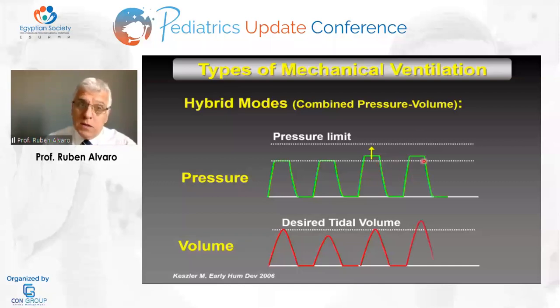But now with this PIP, the tidal volume is going to be higher than the desired tidal volume. So the machine will again adjust that PIP and bring it back down to see if that will give you the desired tidal volume. And that's the way the ventilator works, breath by breath. Keep adjusting the PIP, trying to achieve the volume that you set on the ventilator.